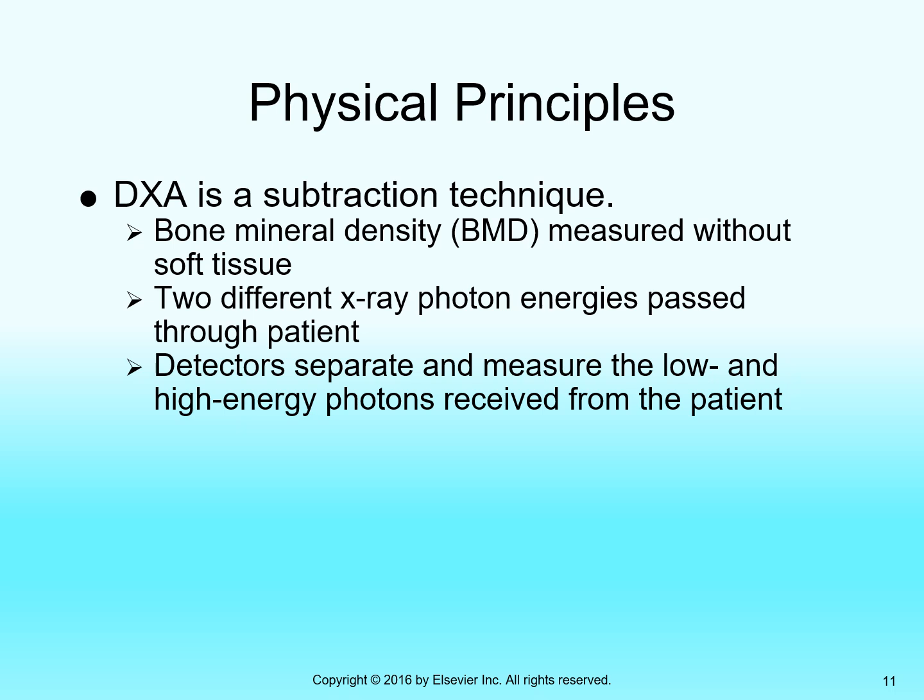And then it'll collect more data, and there should be a difference in the strength of the remnant beam because the penetration power of the beam is increasing and nothing else is changing. And so by subtracting the strength of the low energy beam from the high energy beam, we can map a profile and isolate tissue that basically has calcium in it, because it allows us to subtract away the soft tissue and isolate just bony tissue with the dual energy. Okay.